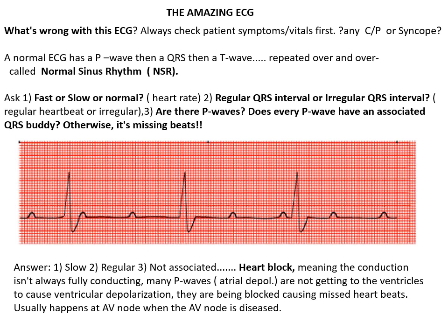at all together. Okay, because typically the P wave should be followed by a QRS, which should be followed by a T wave. And this is not happening here at all. Okay, so not that we need to learn about third-degree heart blocks here, but I'm just trying to teach you what normal sinus rhythm is. And this is definitely not an example of normal sinus rhythm. Okay, the electricity that started as a P wave is not being conducted to generate a QRS.